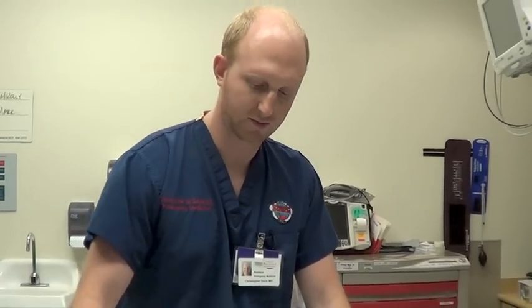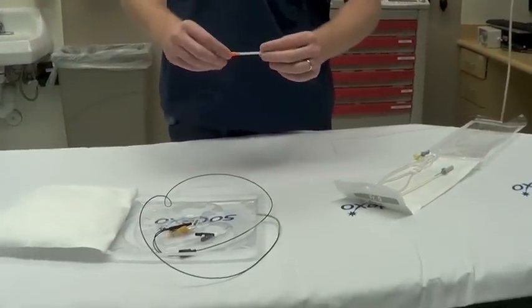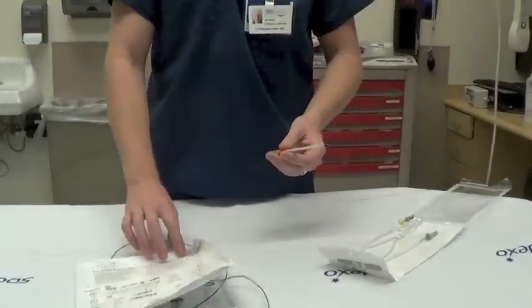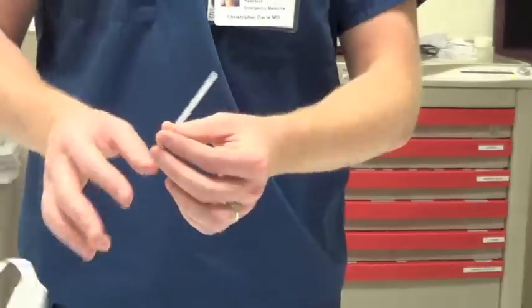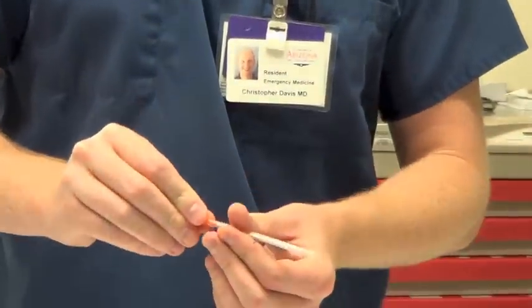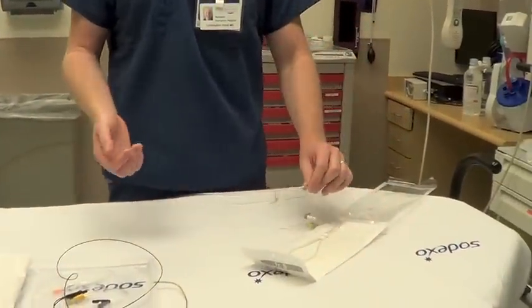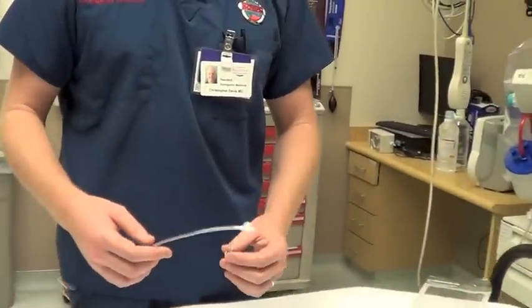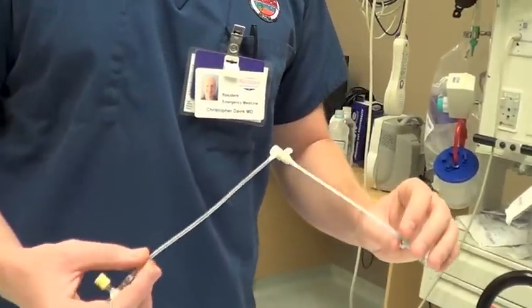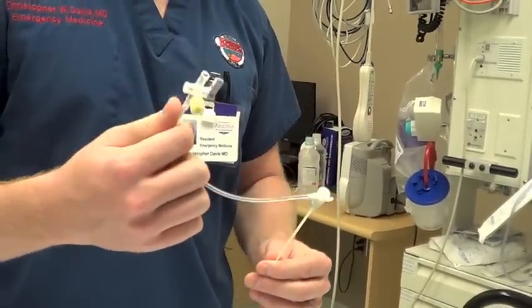There are really two types of catheters you can choose from. The first is this five French central venous catheter without any ports on it. If you're doing this on a patient that you think you'll need to start pressers on — which is probably most patients you'll be doing this procedure on — you might want to opt instead for this five French that has a medication and aspiration port.